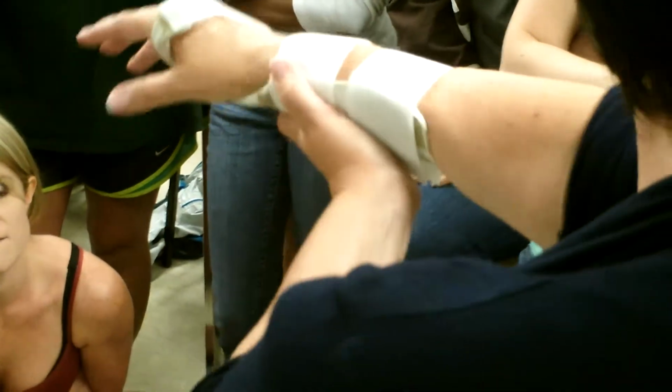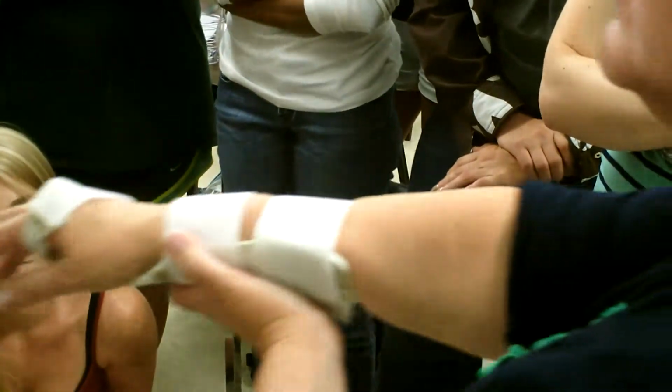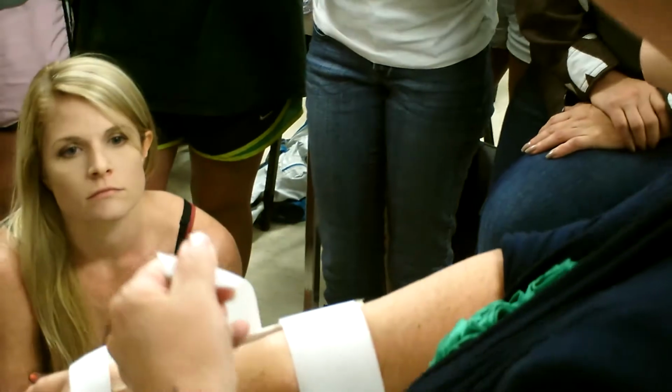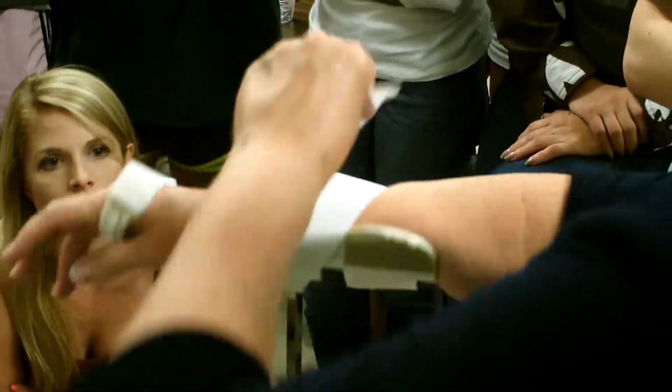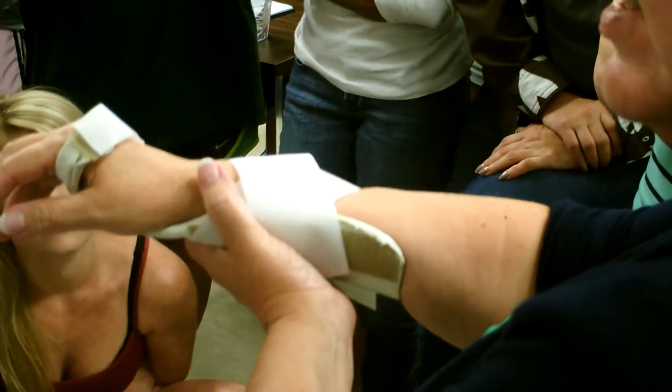Okay, so it's still kind of moving even though I tighten the straps. So how about the placement of the strap, like not straight across? I could go crisscross applesauce and then prevent it. Okay? So there's other options.